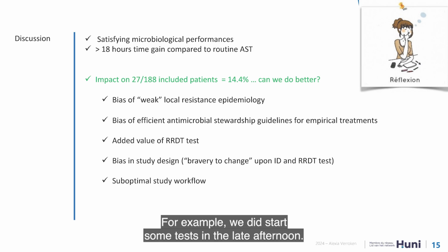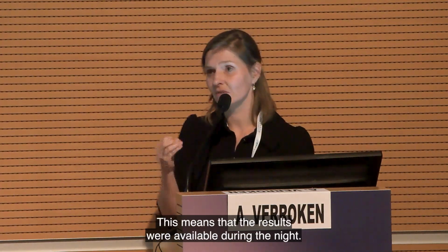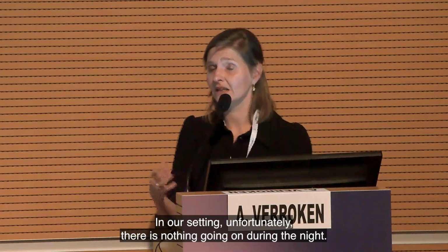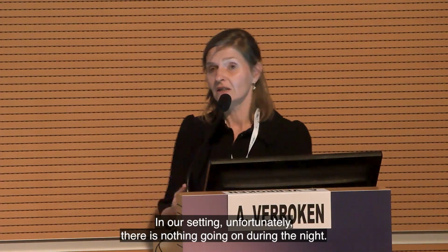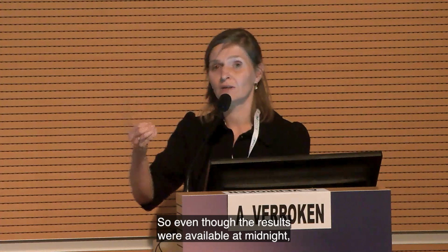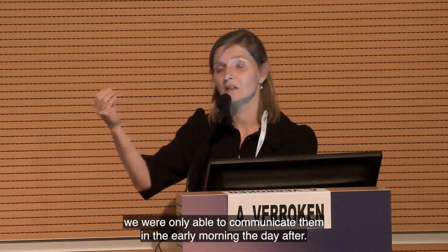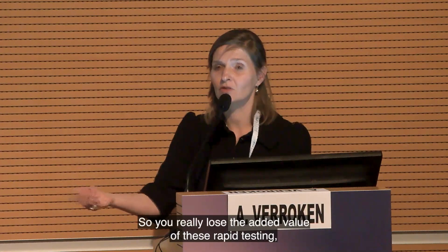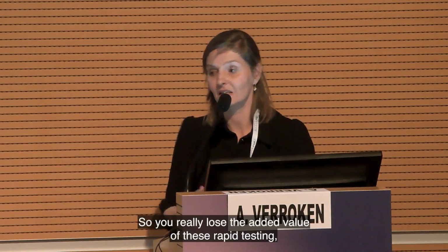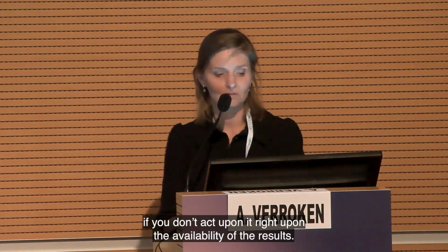For example, we did start some tests in the late afternoon. This means that the results were available during the night. In our setting, like I said, unfortunately, there is nothing going on during the night. So even though the results were available at midnight, we were only able to communicate them in the early morning the day after. So you really lose the added value of these rapid testing if you don't act upon it right upon the availability of the results.